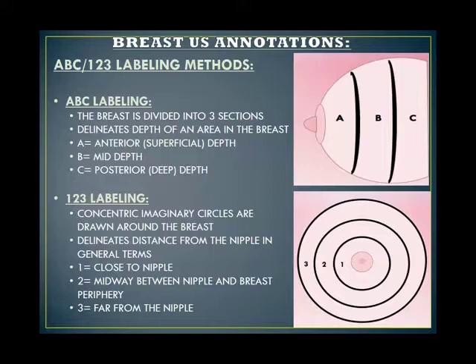So from that, I would be able to get in the right breast at 2 o'clock position, superficial depth on the ultrasound image, and it's in zone 2, meaning it's halfway between the nipple and the outer edges of the breast.